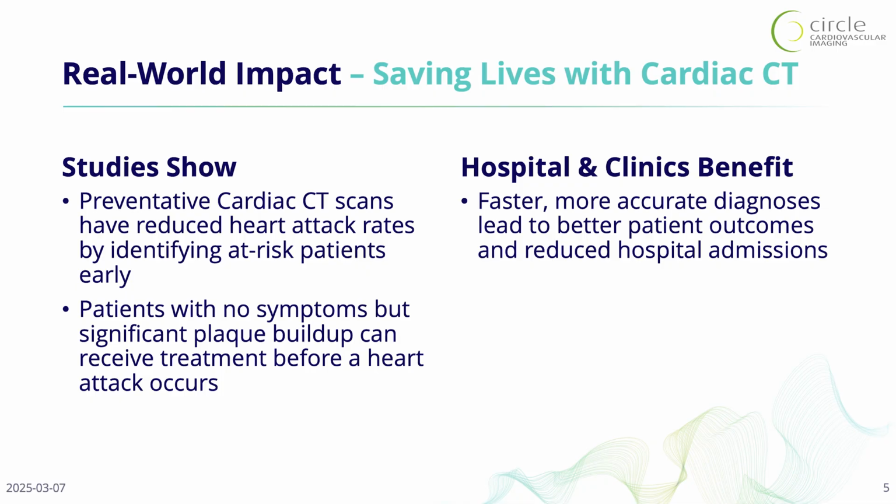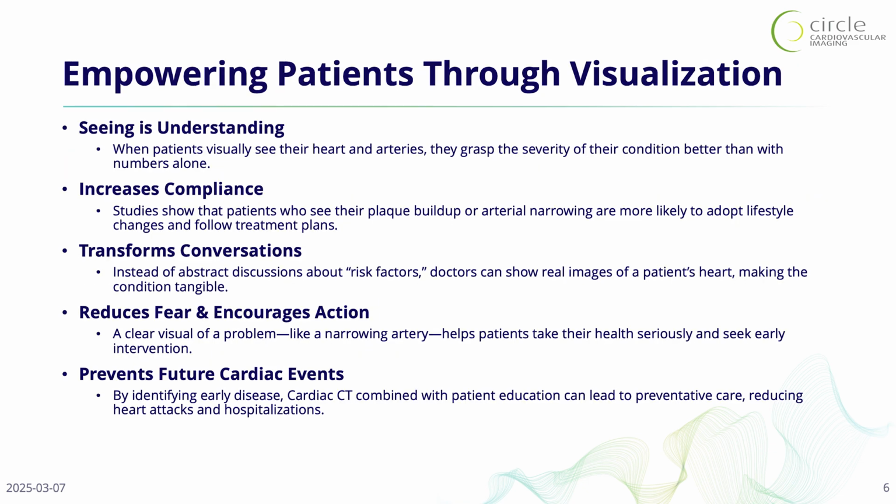And the real-world impact. Studies show that preventative cardiac CT scans have reduced heart attack rates by identifying at-risk patients, and patients with no symptoms but significant plaque buildup can receive treatment before the heart attack occurs. And hospitals and clinics benefit: faster, more accurate diagnosis leads to better patient outcomes and reduced hospital admissions. And empowering patients through the visualization.